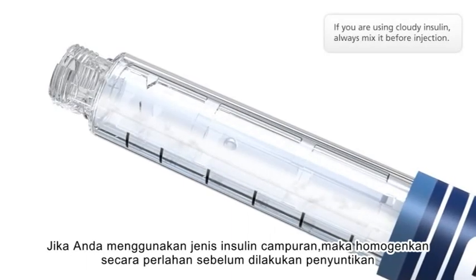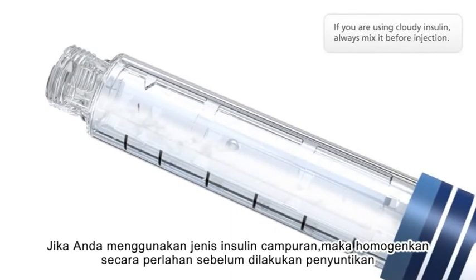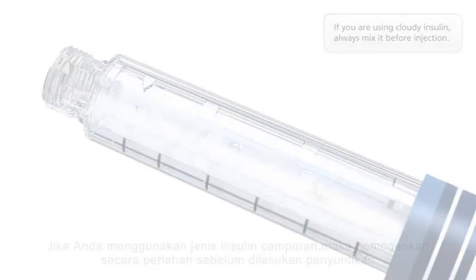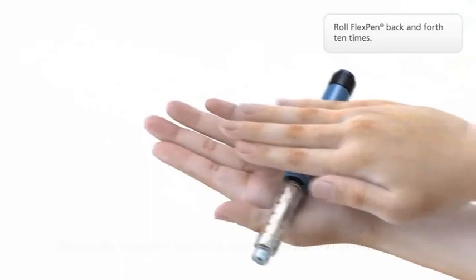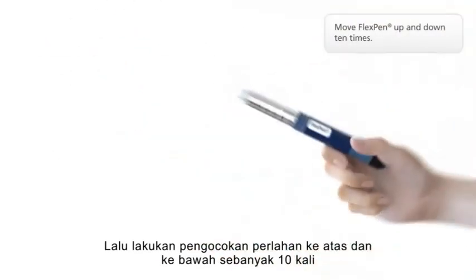If you're using cloudy insulin, always mix it before injection. Roll FlexPen back and forth ten times, then move it up and down ten times.